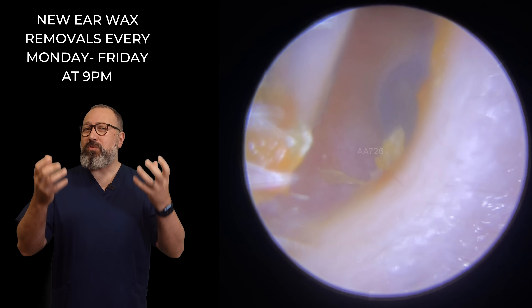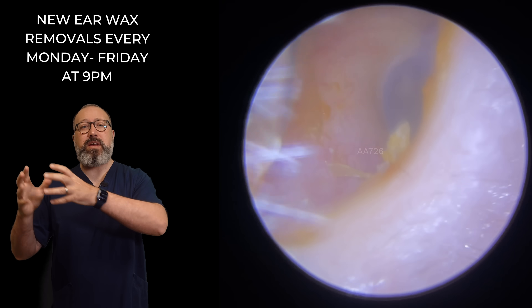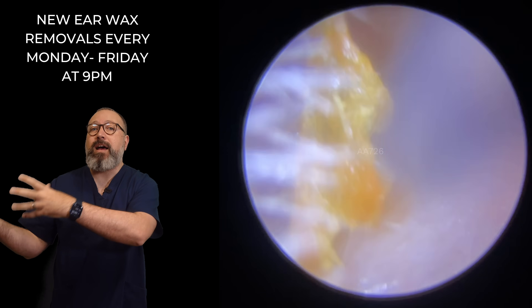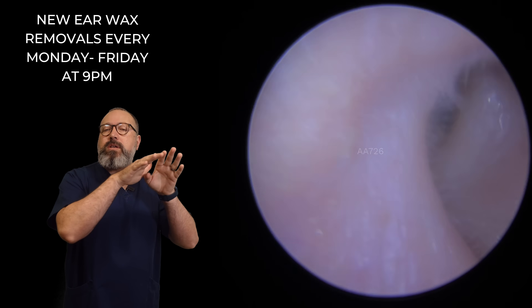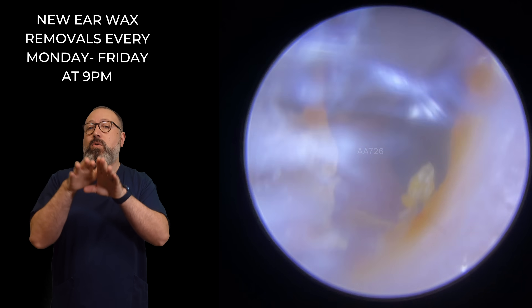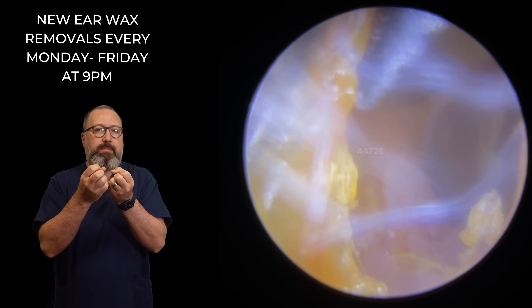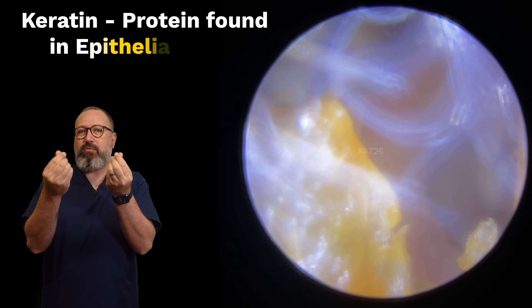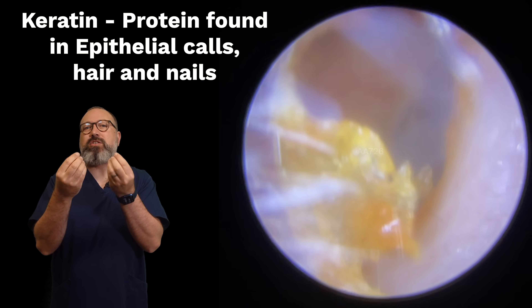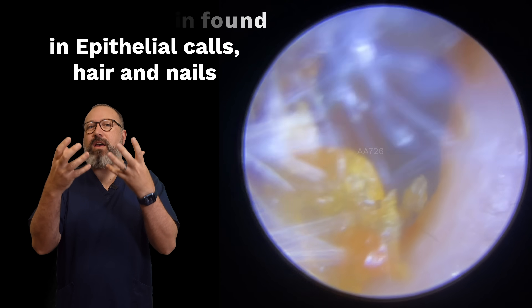Remember the conveyor belt motion of epithelial cells — moving off the eardrum, forming the canal wall skin, going from medial to lateral. By the time it reaches that outermost lateral portion of the ear canal, it will have dried out. The keratin, that protein inside these epithelial cells, is really drying — you can see it's hardened and toughened up that skin.